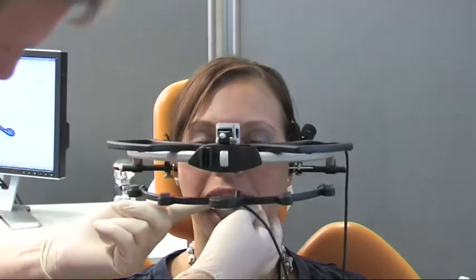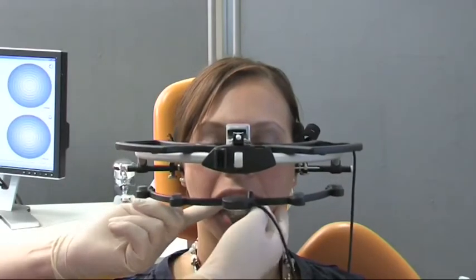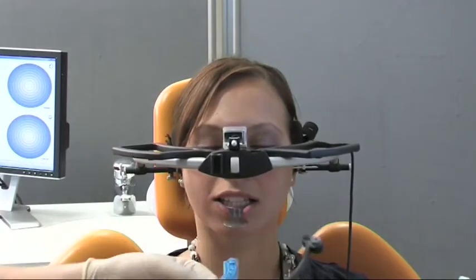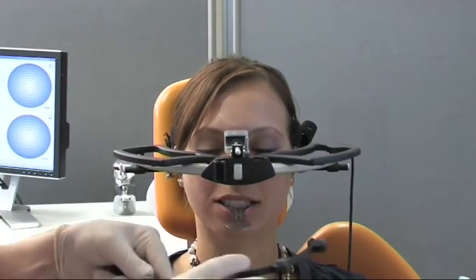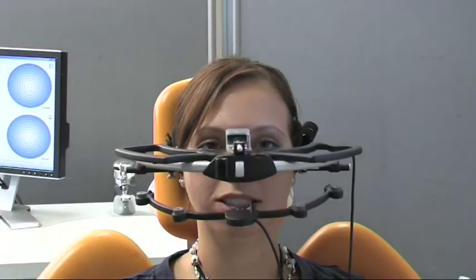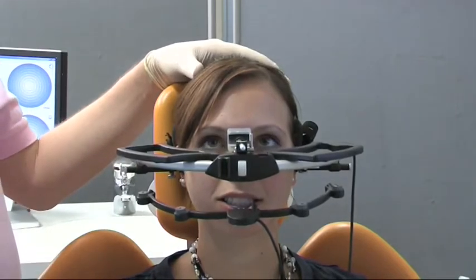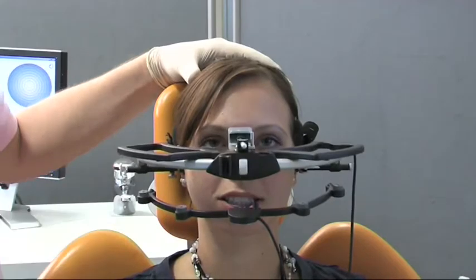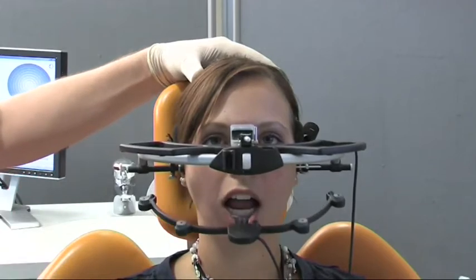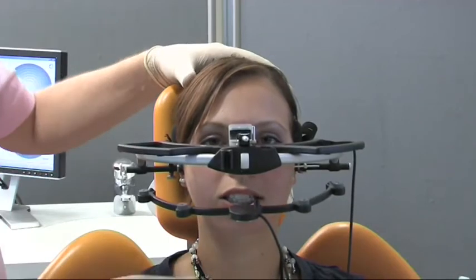I'll hold this firmly on both sides. You don't need to do anything, just hold still. Bite down please. Good, very good. Now open your mouth wide and close, making sure the teeth do not make contact. Do this five or six times — open and close without tooth contact. Open wide and close with no tooth contact.